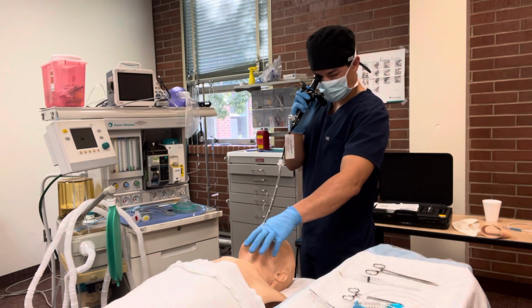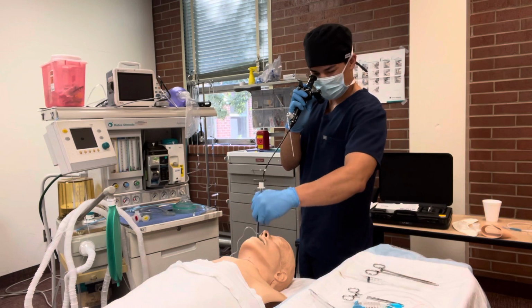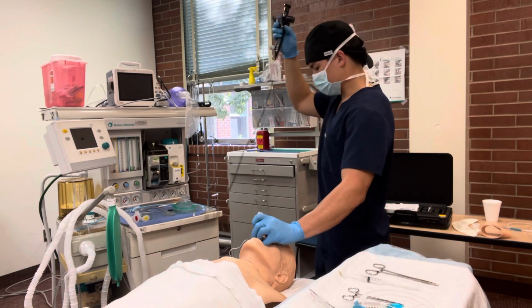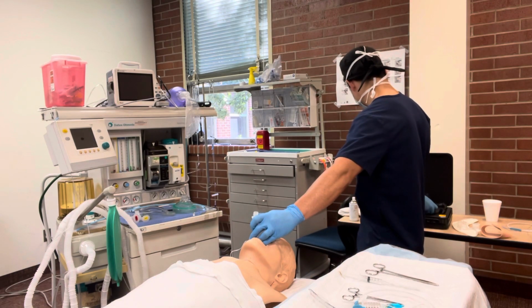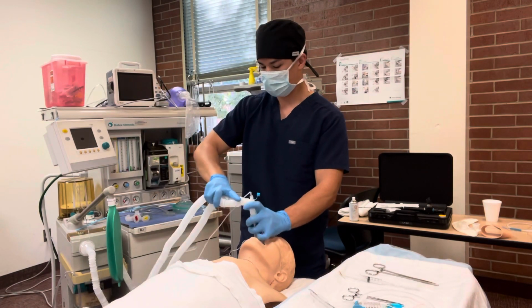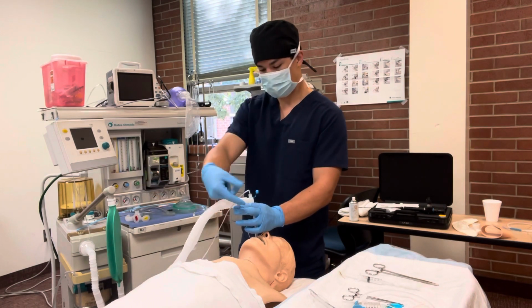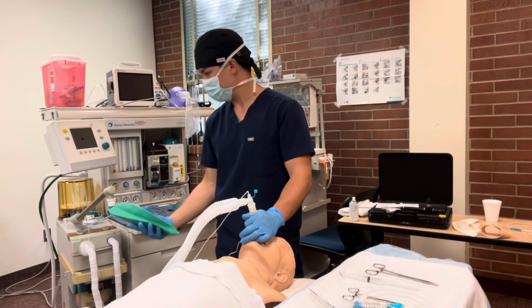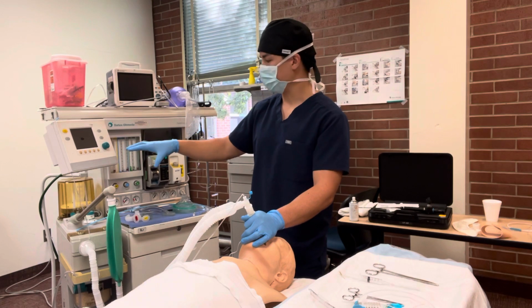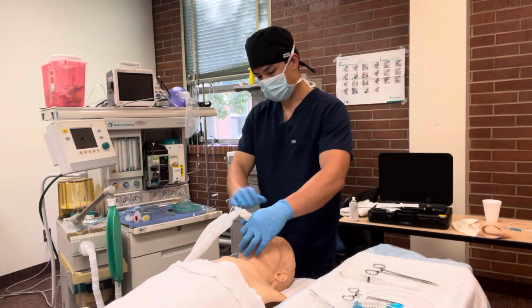Once I see my vocal cords, I'm going to thread down my tube, remove this bronchoscope, attach my circuit, inflate my cuff. I'm going to give a few ventilations and make sure I have end-tidal CO2 on the monitor. My SpO2 is maintaining, equal bilateral chest rise and fall. I'm going to auscultate and secure my tube.